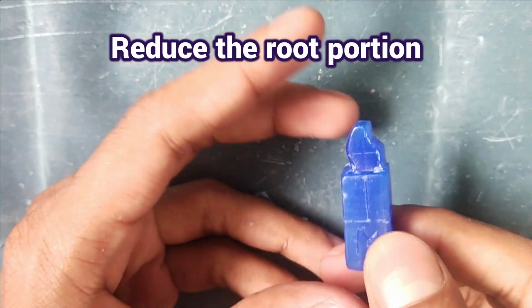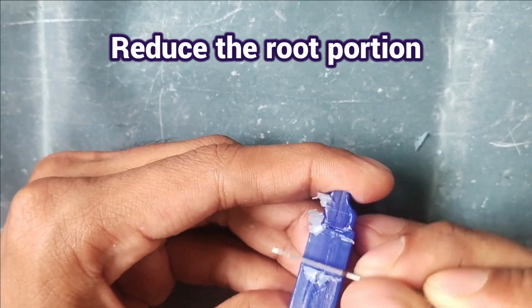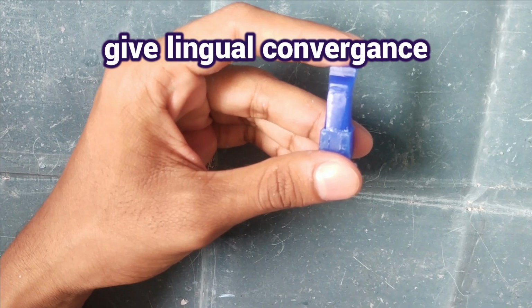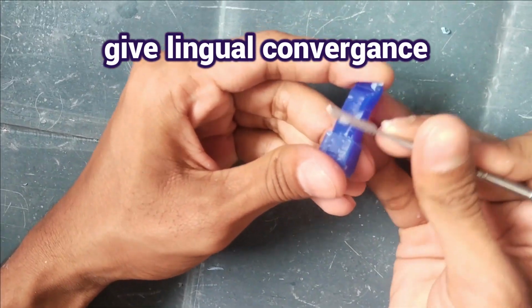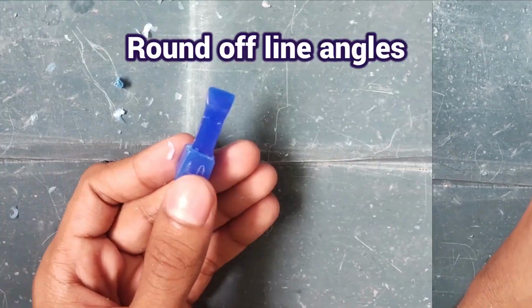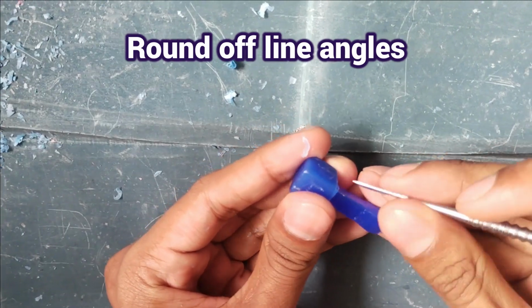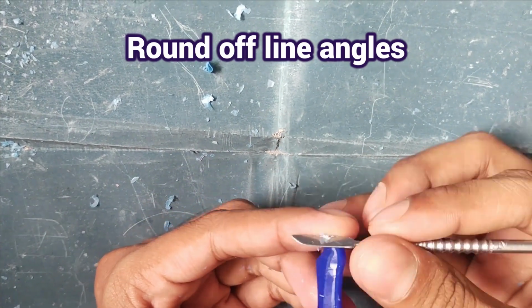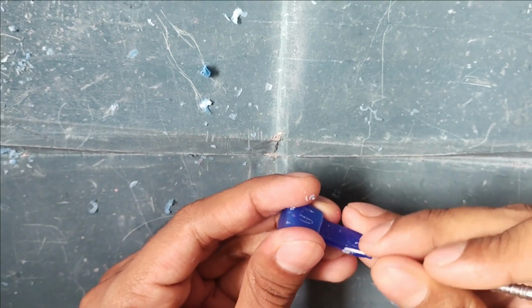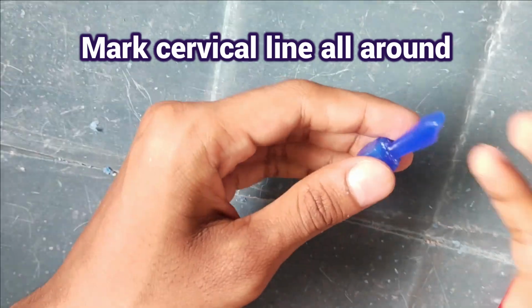After this, gross reduction of the root. Root is reduced grossly. Now we do the lingual convergence. Round off all the line angles of the crown and the root. After rounding off, now mark the cervical line.